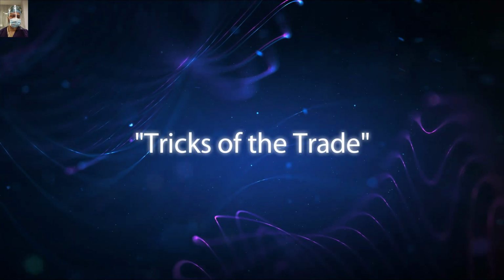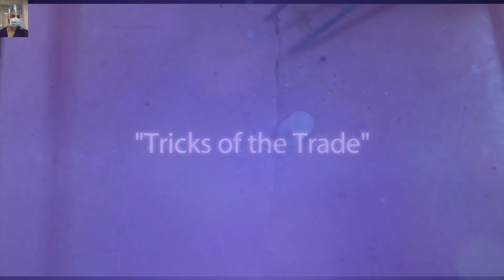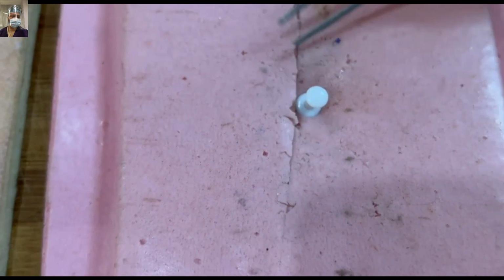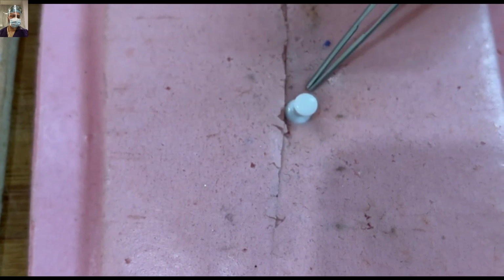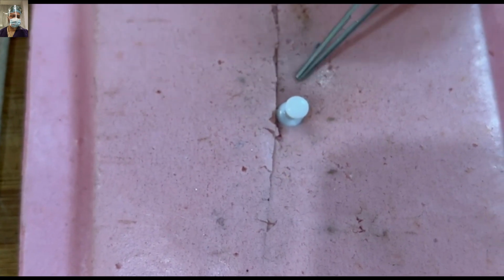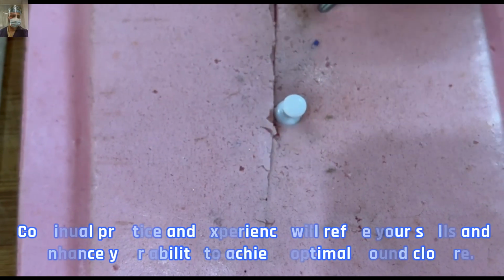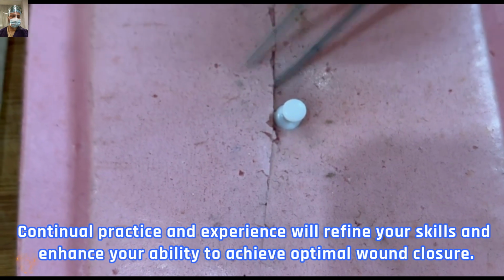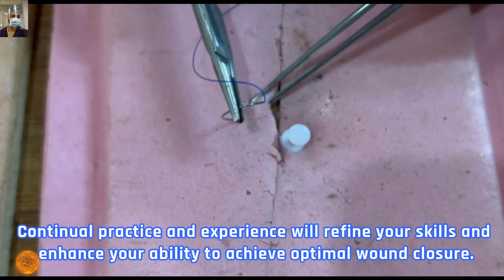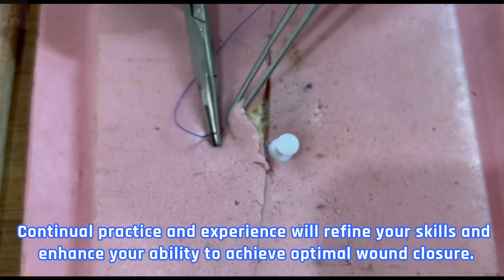So friends, another trick of the trade I'll share with you guys. There will be some situations where one edge of the wound is below the other edge, especially when there's a tissue loss, or you have excised some tissue, or there's a trauma. Like here, we have created that effect with the help of this pin. So how do we then oppose these edges?